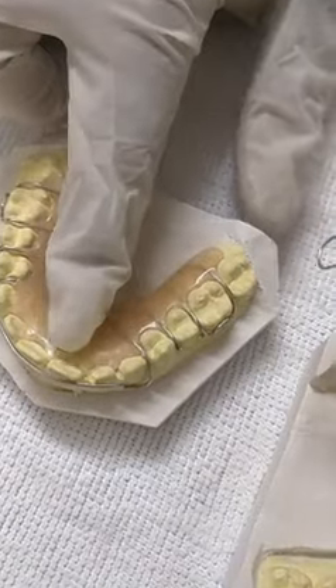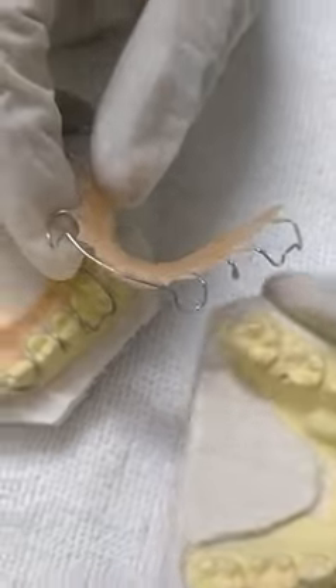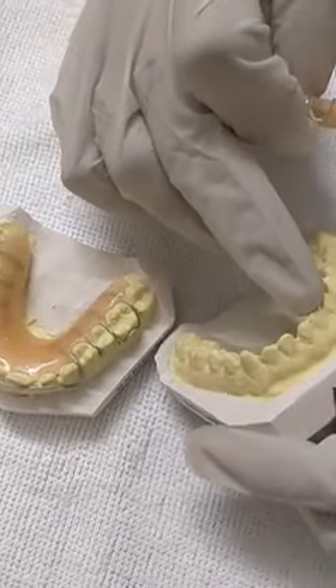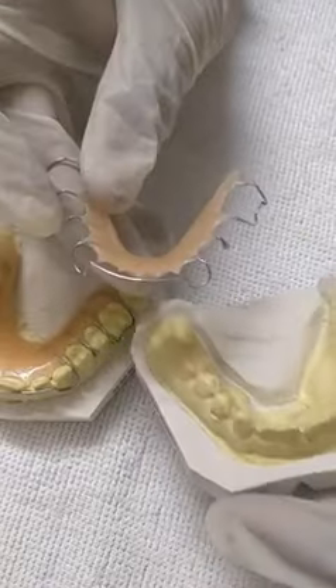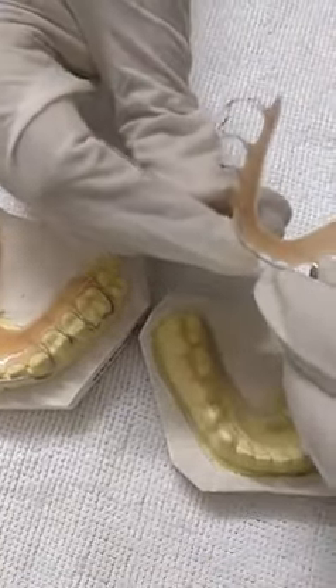This upper retainer is 21 gauge stainless steel, and this lower is 22 gauge stainless steel, because the anterior surface area is small, so I made it with 22 gauge — it is lighter and more flexible.